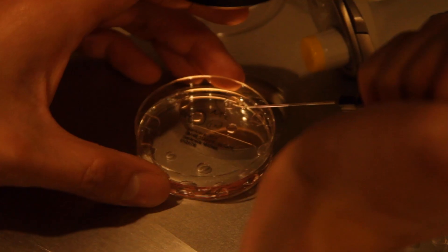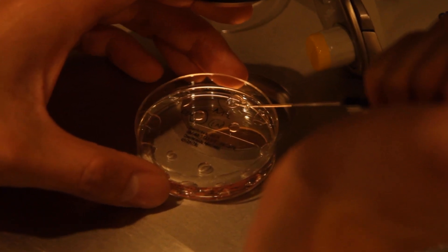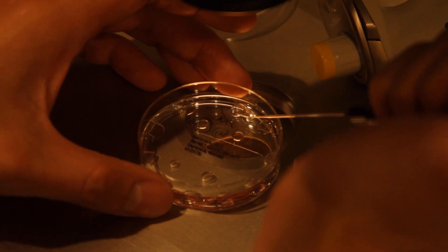This is a procedure where a single individual sperm cell is injected directly into an egg to fertilize it. It's a truly remarkable thing to witness, and we're excited to share it with you today. Now Donna is going to inject a single sperm into each egg that she has on the dish.